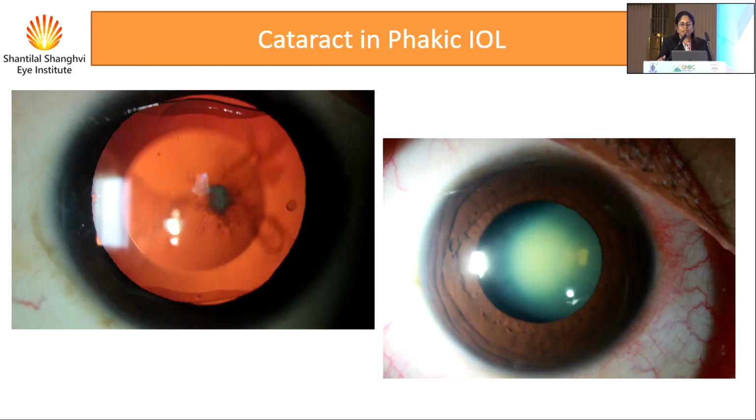Cataract is not uncommon because these are high myopes. We have to differentiate between cataract that could be caused due to touch, like this particular focal cataract, or nuclear cataracts, which can develop in high myopes. They can sort of push it onto you that the surgery has caused. In refractive surgery, anything that happens to the patient for their lives is because of the refractive surgery that we did for them. That's what I've noticed. So here also they usually have that opinion, so we have to just push it across saying that in high myopes, the incidence of cataract is much higher.